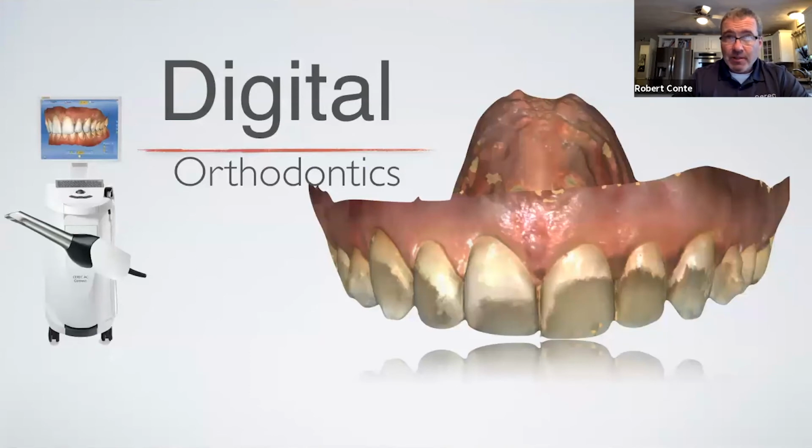And as you know, for aligner therapy, the PVS impression is critical. It has to be accurate. So that's a tough impression to get. You can't have any voids. So let's look at doing some orthodontics digitally.